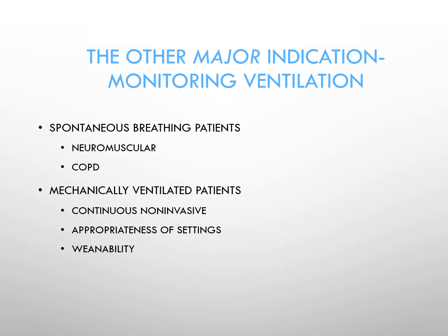Another major indication for capnography is monitoring ventilation, whether it be spontaneous breathing patients, for example neuromuscular patients coming in for their regular checkup, or COPD patients that are doing likewise, that don't have a neuromuscular disorder, but they're, if you will, prone to retain CO2.